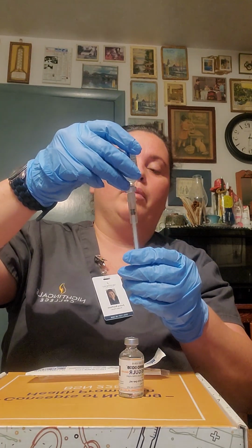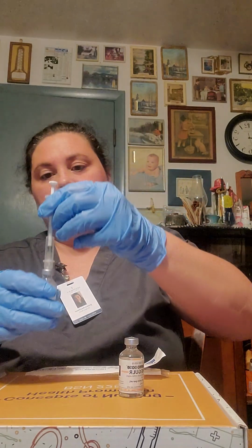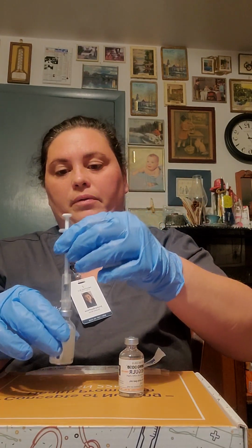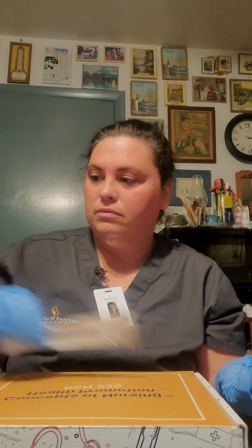Okay, and I have no air bubbles, so I don't need to flick. Alright. Going to pull out. Alright, I'm going to move this out of the way here for a second. And that would be in the trash.